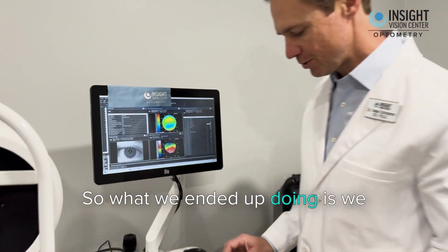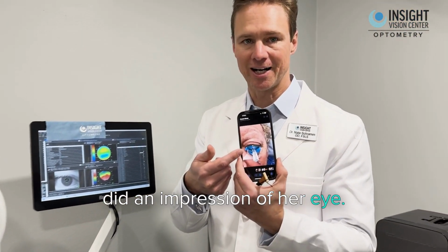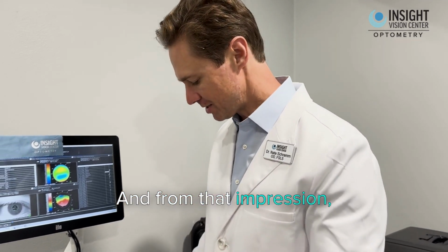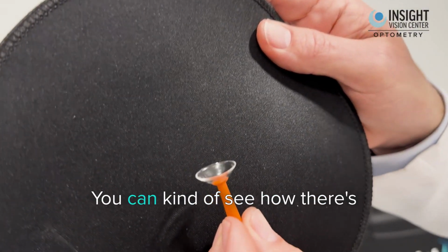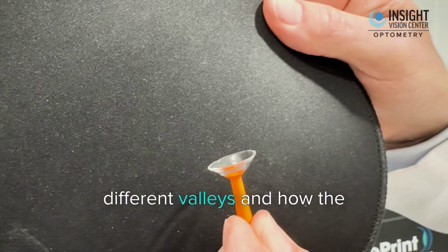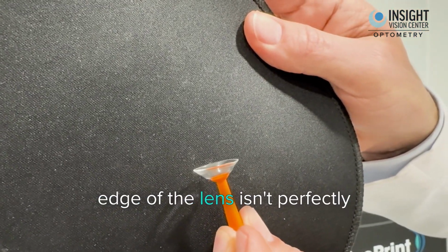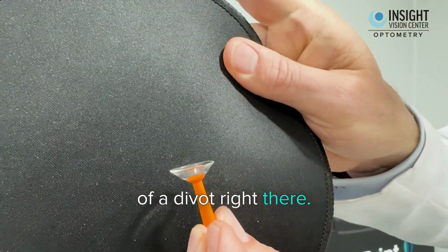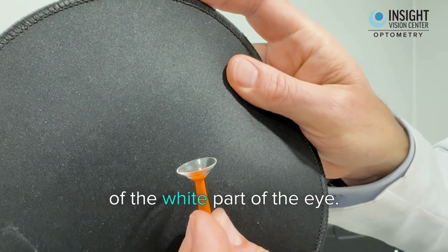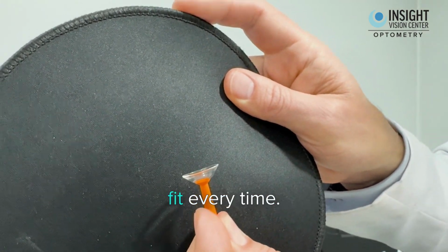So what we ended up doing is we did an impression of her eye, and from that impression, we can make a scleral lens that is very contoured. You can see how there's different valleys and how the edge of the lens isn't perfectly symmetrical. You can even see a little bit of a divot right there. So it matches the exact contour of the white part of the eye. So we have an excellent fit every time.